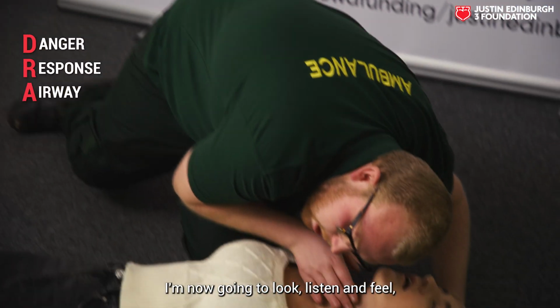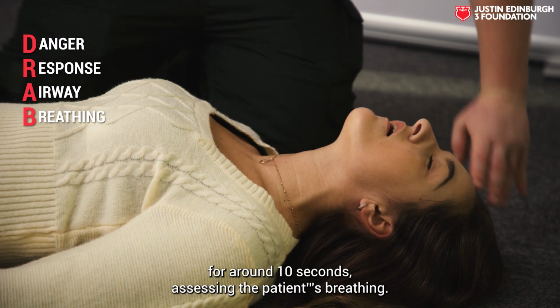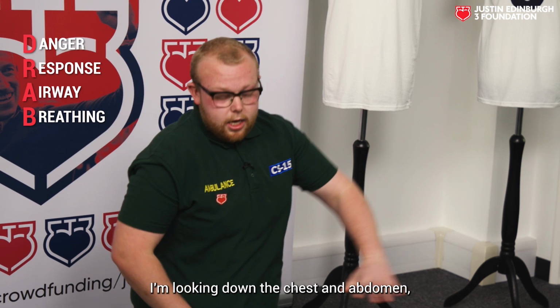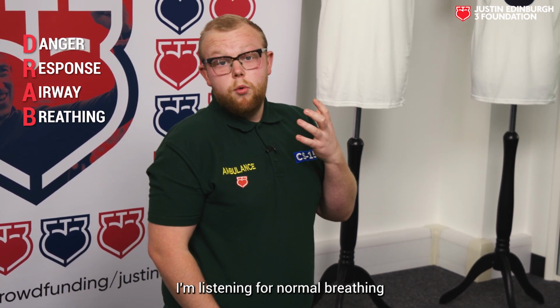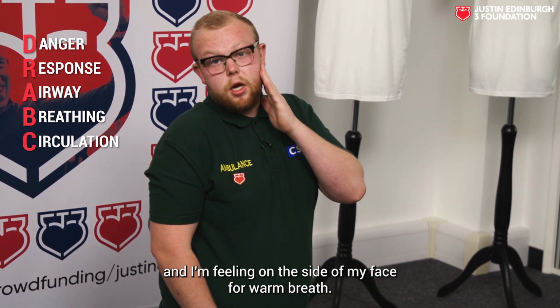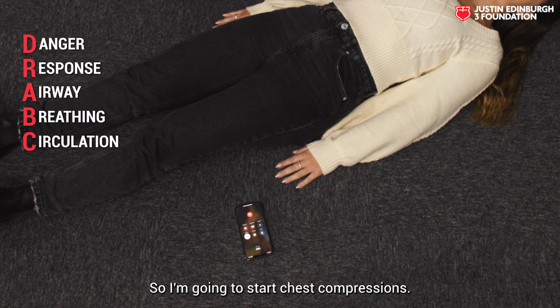I'm now going to look, listen and feel for around 10 seconds, assessing the patient's breathing. I'm looking down the chest and abdomen to see rise and fall. I'm listening for normal breathing and I'm feeling on the side of my face for warm breath. In this situation, the patient isn't breathing normally, they're unresponsive, so I'm going to start chest compressions.